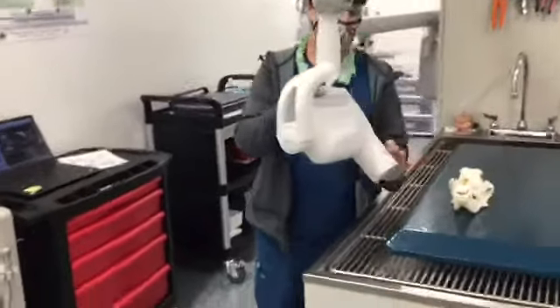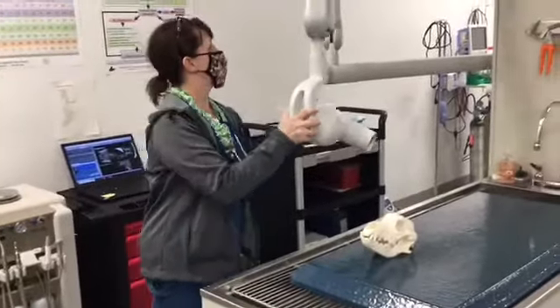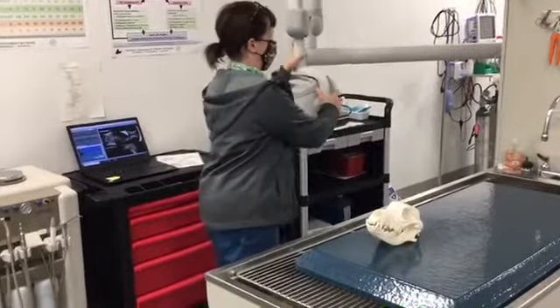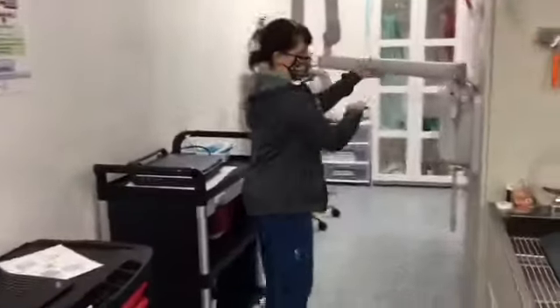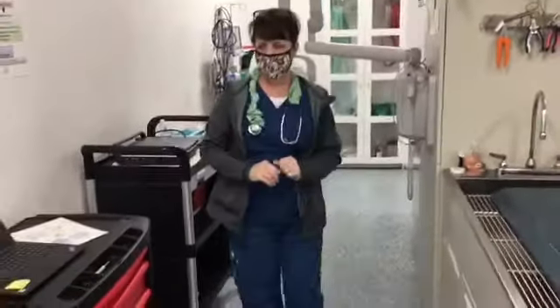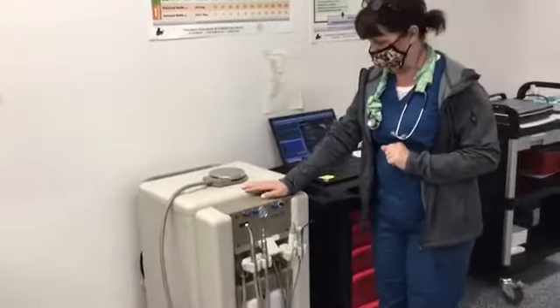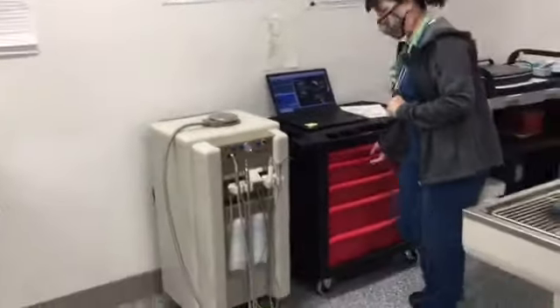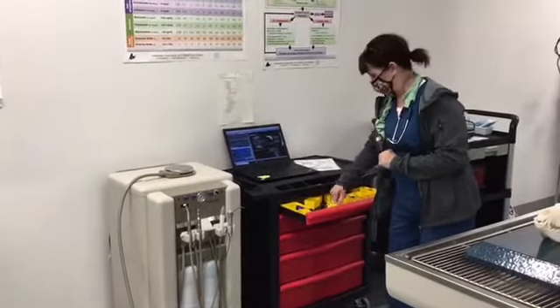So again, this is the machine that we use to take radiographs. So when we're done with that machine, we took all the pictures that we need. I can move that out of my way. We will go ahead and use the machine that cleans the teeth. And so I have a lot of pieces in here that we use to clean teeth.